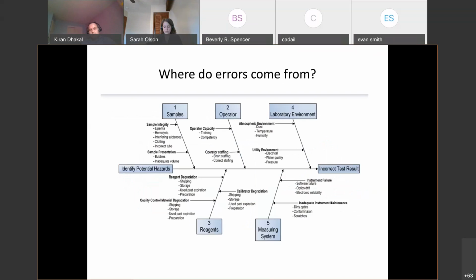So in laboratory analysis, there are various sources of error. The measurement error can come from the sample itself. For example, maybe the sample is clotting, there are interfering substances, people take a variety of food, a variety of things, and their urine is so different. It depends on what kind of diet they had. It can come from operator to operator variations.